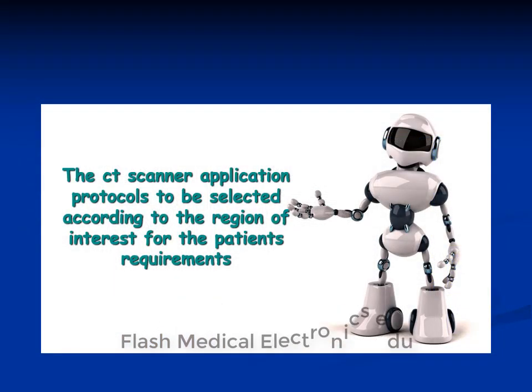The CT scanner application protocols are to be selected according to the region of interest and the patient's requirements.